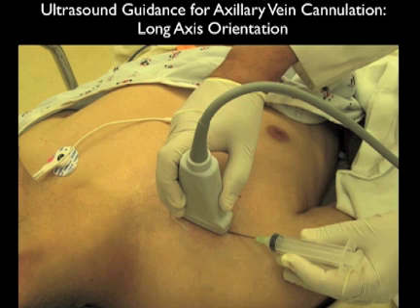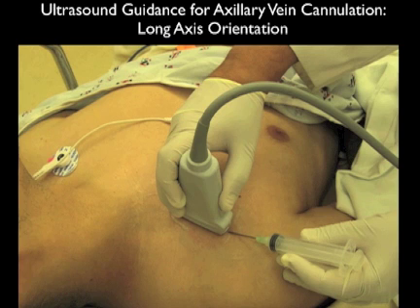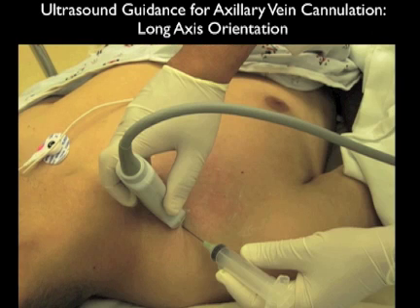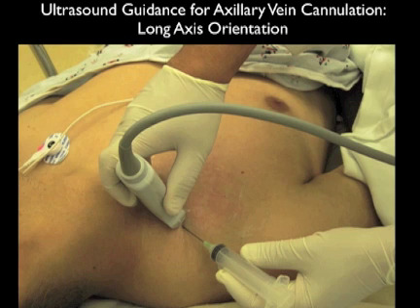Here are images showing the appropriate positioning of the probe for long axis cannulation of the axillary vein. We have the high frequency linear array probe positioned over the lateral chest wall directly over the axillary vein, with the needle coming in under the long axis of the probe. I like to have the probe positioned so that the marker is oriented laterally, so the needle will come in underneath the indicator and progress directly underneath the probe as it courses from the skin down to the axillary vein. It's important to keep the needle in plane underneath the probe at all times so it can be visualized as it goes down to the vessel.